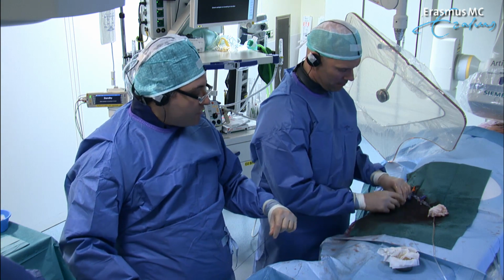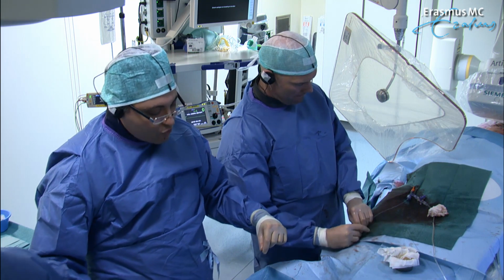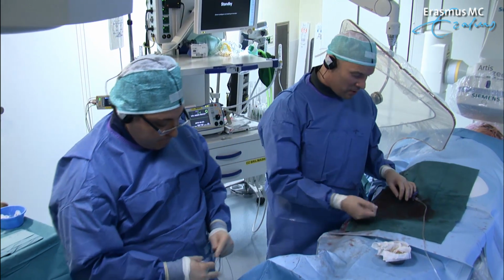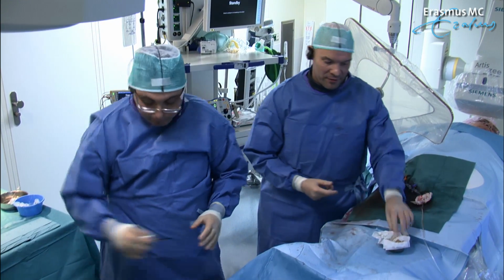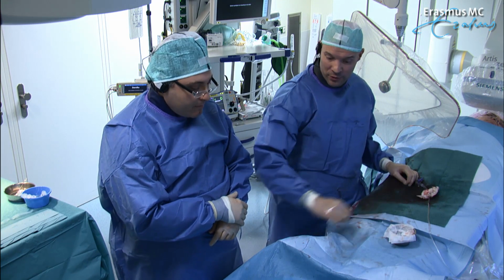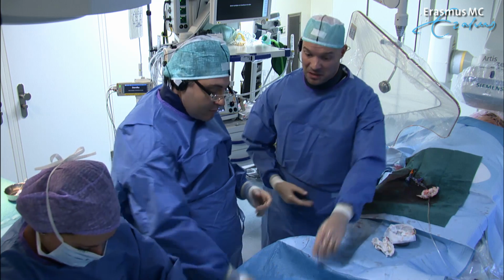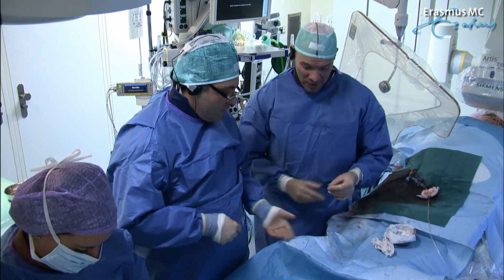So Nicolas, we are really treating the remaining disease after having treated the most complex and important lesion. When you have sequential lesions, the interpretation of your baseline FFR can be very challenging, and it's always worthwhile to repeat your FFR measurement after you've tackled one of the lesions. In this case, I think it's a good thing that we did our confirmation FFR.